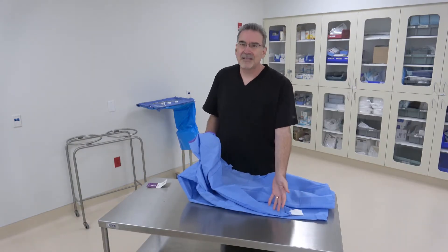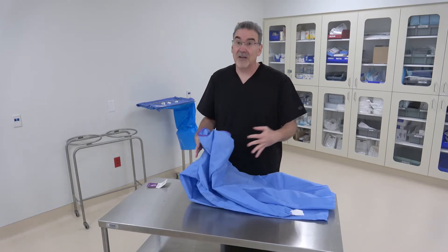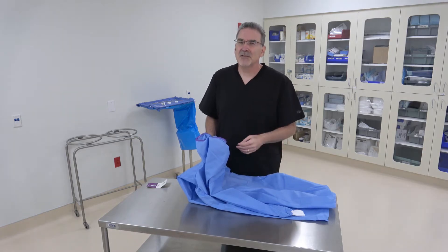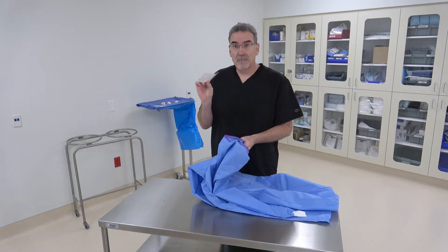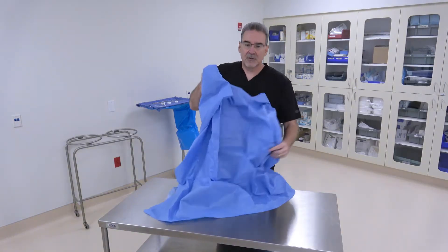Make sure you have a nice big table. I've got a back table here, which is probably the smallest size table we want to work with — a bigger table will be even easier. Also make sure you have your tag, your card, to make sure that the ties go on properly.